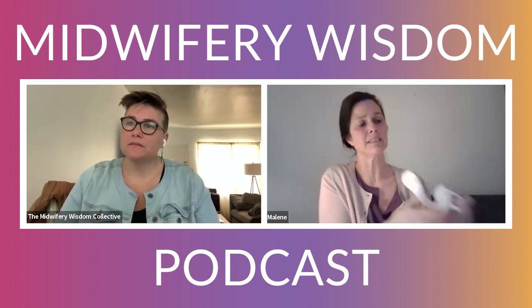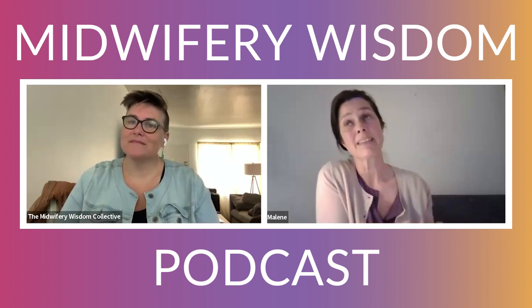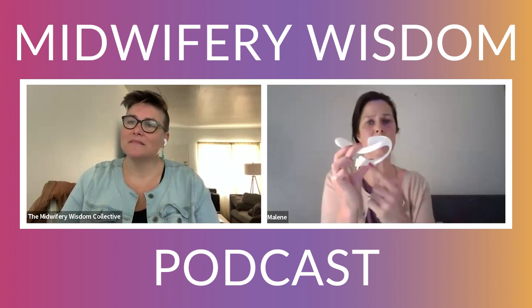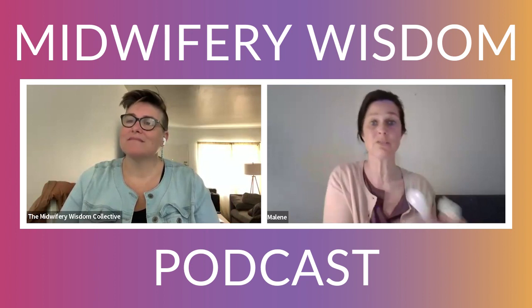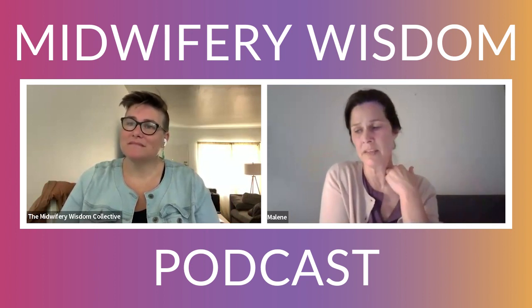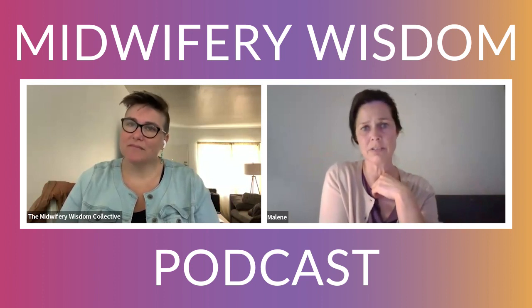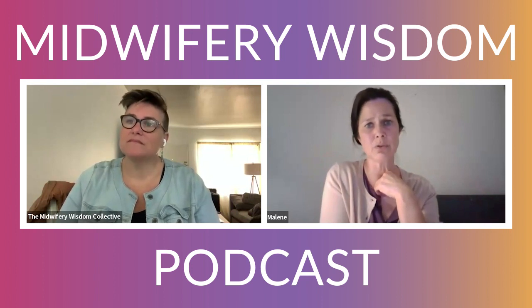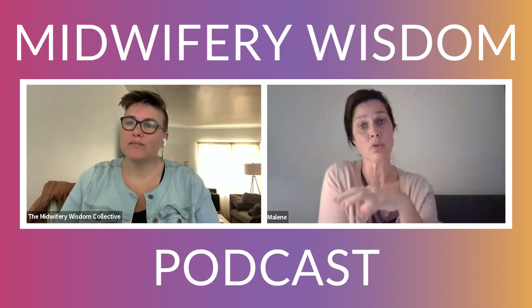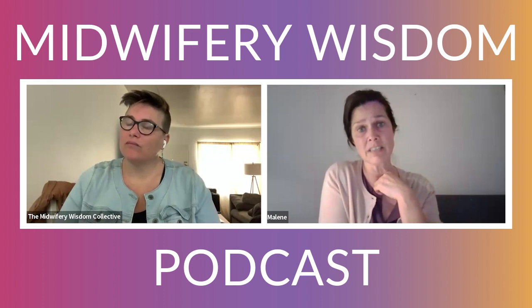But it needs the flexibility. It has to be very, very flexible. Back in the days, I thought of making it out of aluminum, but that would simply be so sharp here that it would cut up the vagina when you removed it. So it would simply not be approved. And it took about a year to decide on the material. So it's not something that you just sleep over. It's a lot of testing. It's a lot of discussions back and forth. I did have a board when I did it. So I had some really good people around me I could discuss all these things with.